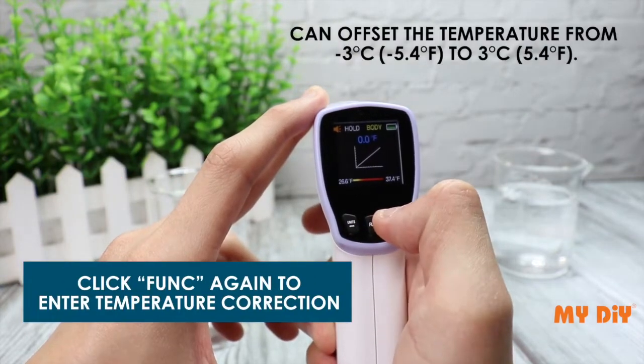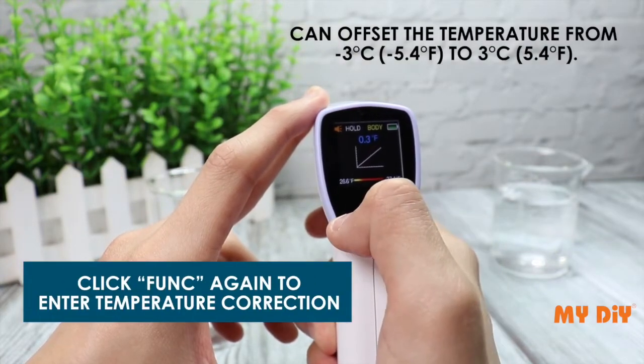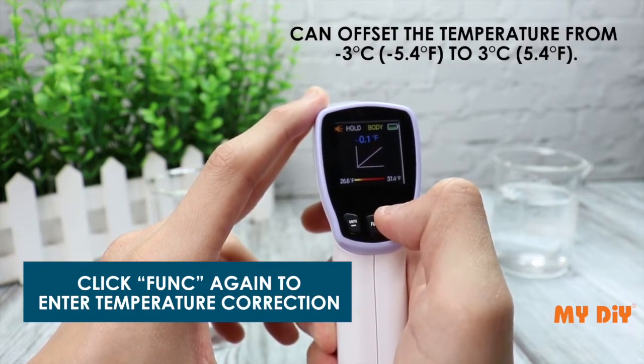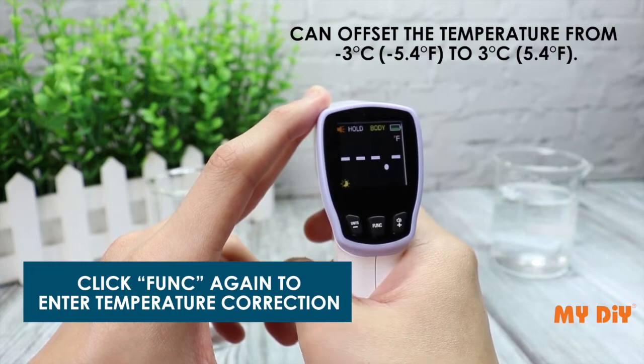Click funk again to enter temperature correction. You can offset the temperature from negative 3 to 3 degrees Celsius, or negative 5.4 to 5.4 degrees Fahrenheit.